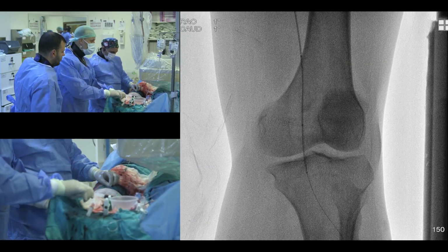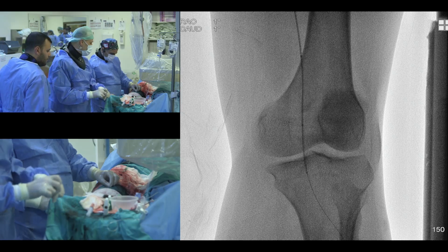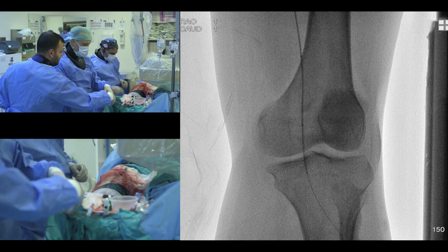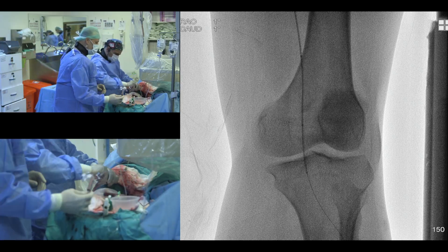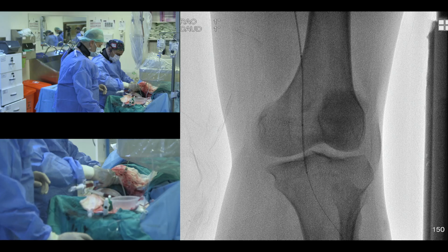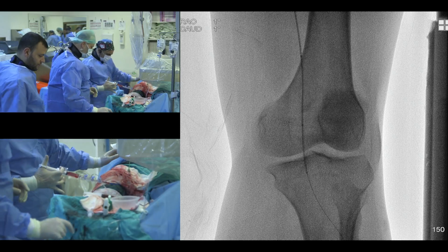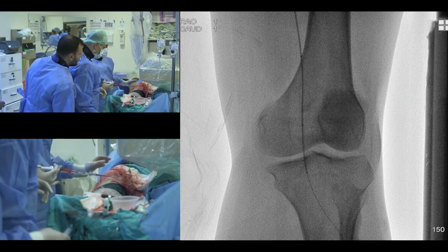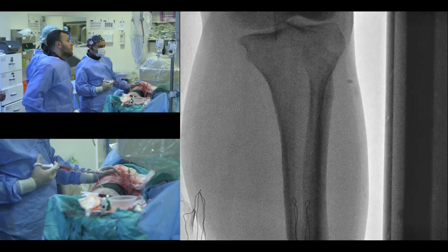But there are times I will do contralateral, if the disease is up to mid-calf. Now, the second point is don't use a 45 centimeter sheath. If you don't have SFA disease, use a 65 or a 90 centimeter long sheath, especially when you're coming contralateral. If you're going antegrade, 45 is fine.